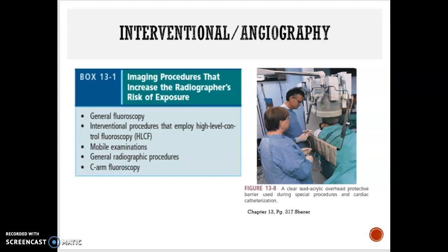Personnel working in these areas must be aware of the radiation hazards involved and make every effort to adhere to the requirements and recommendations set out by their facility or department, or they could look up basic safety guidelines, or guidelines recommended by Safety Code 35. Either way, they should be aware of the risks and how to reduce them. They should make full use of protective devices.